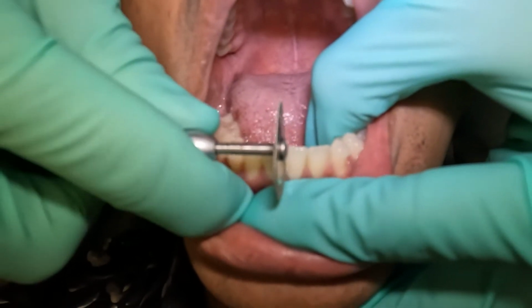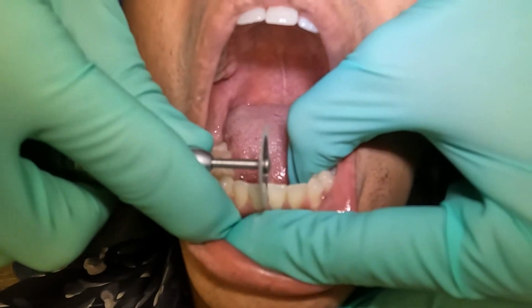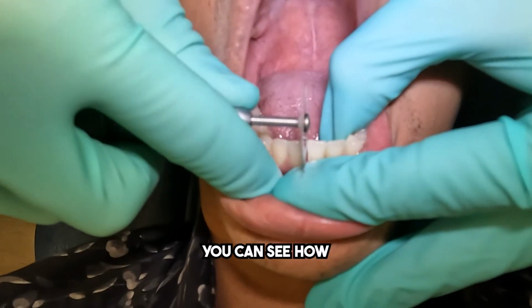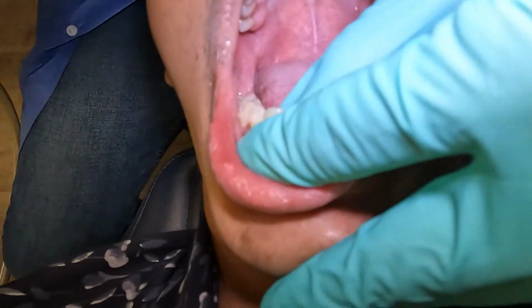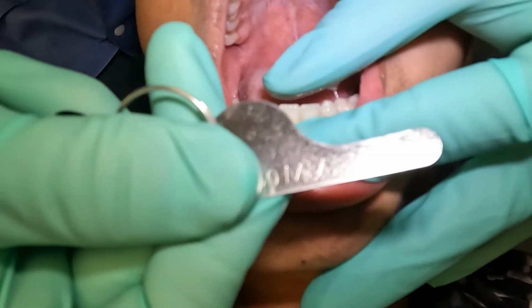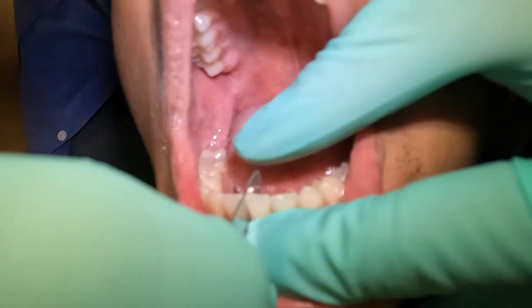And so then we go up and down. You can see how it looks like it's getting right next to the gums. Okay, so then when we think we got the right space, we're going to come back and do a little check. And we take our little 0.5 millimeters and we slip it through. Bada bing, bada boom. It just slips right in.